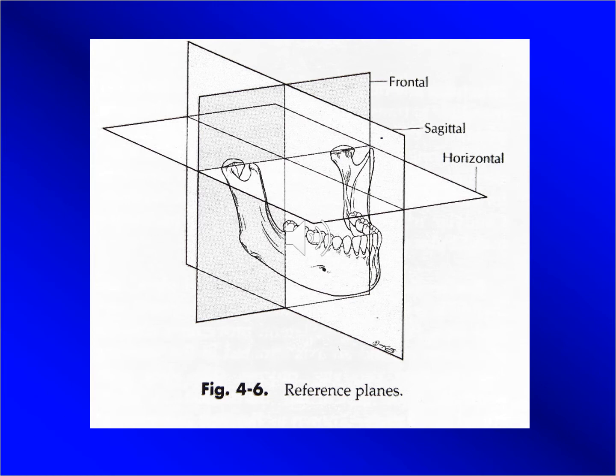Okay? And now the condyles can be centers of rotation, or they can also rotate themselves or translate out of their most retruded position. And when they do so, the condyles are forced to move downwards or in another direction in relation to the maxilla, because of the anatomy of the glenoid fossa. The downwards movement of the condyle is going to affect the teeth that are attached to the mandible and will cause some separation between the upper and the lower teeth closer to that downward moving joint. Now, to understand mandibular position, it's like any three-dimensional object. All we need to know is the location of 3 points attached to that rigid body.